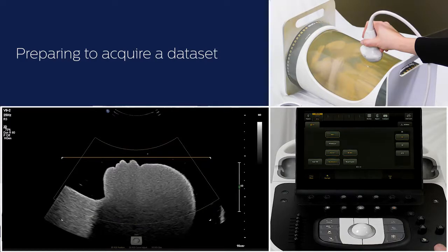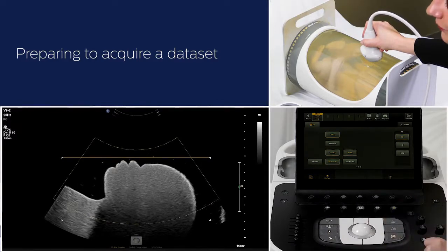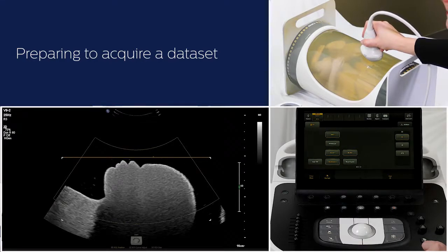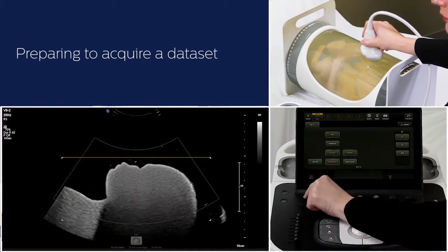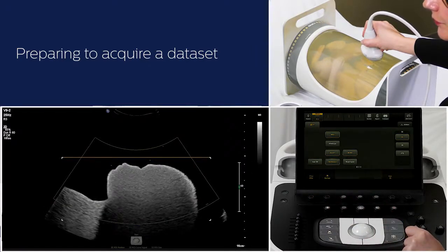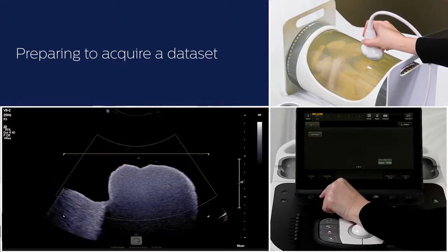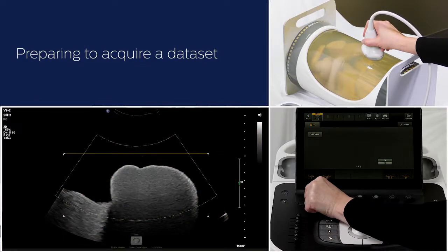Further settings can be changed to increase the resolution of the 3D dataset. Adjust the angle if a bigger or smaller sweep is needed. For example, an acquisition of the fetal spine will require a smaller sweep and therefore angle than the fetal face. The 2D opt can be changed to res. A gen and pen setting is also available. On the second page of the touchscreen, changes can be made to the chroma map and/or gray map.